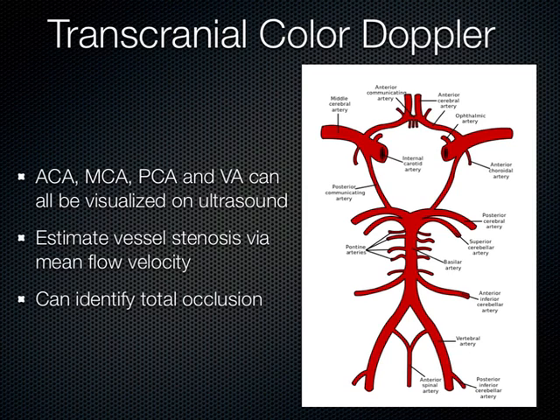And there's been a lot of work looking at patients who are having a stroke, not only identifying which vessel with ultrasound, but also potentiating the effects of a clot-busting drug like TPA. Using smaller doses of TPA, because it has a lot of side effects, and then when the TPA arrives at the location of the clot, you can activate or potentiate its effects using ultrasound to help increase the surface area of the clot for the TPA to work on.